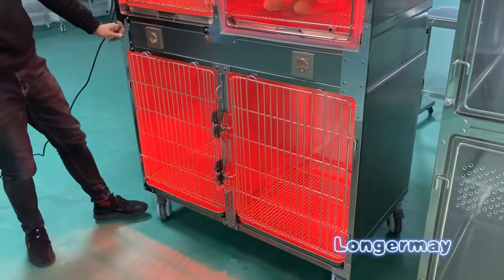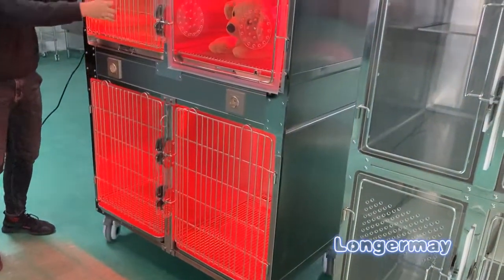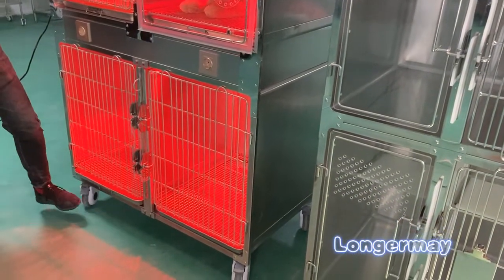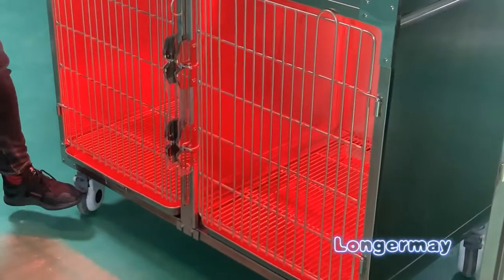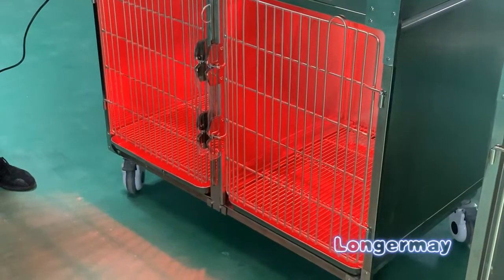And the wheels are movable and also lockable. You can see that we can move it very easily now. Each one has a lock. Now we cannot move.